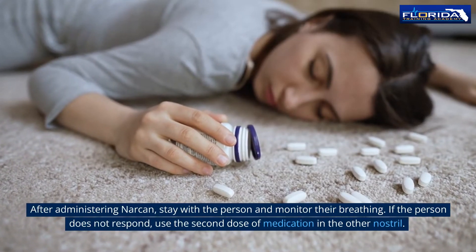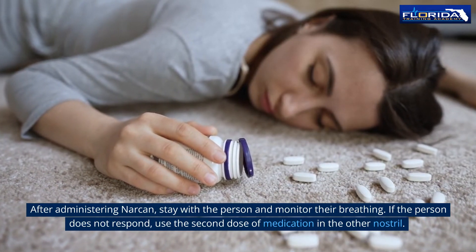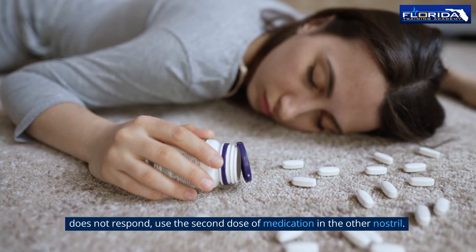After administering Narcan, stay with the person and monitor their breathing. If the person does not respond, use the second dose of medication in the other nostril.